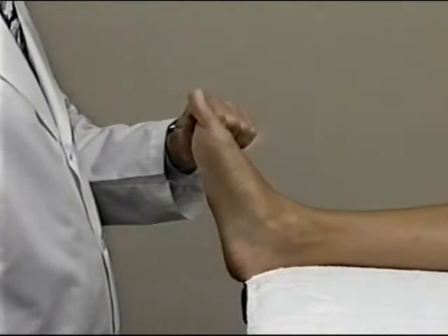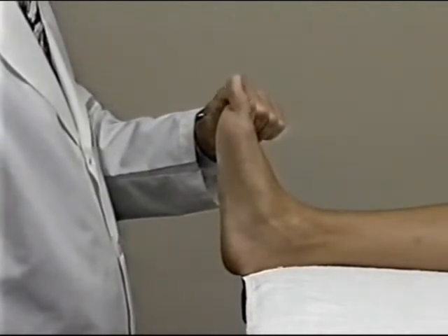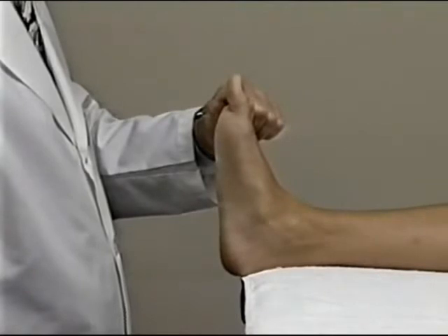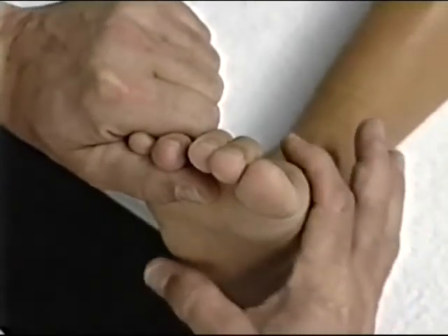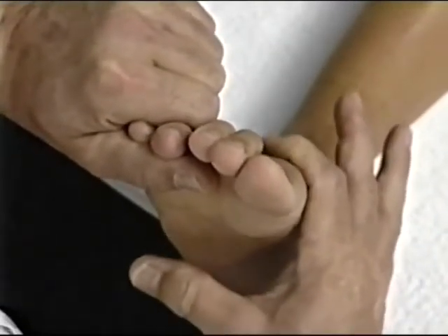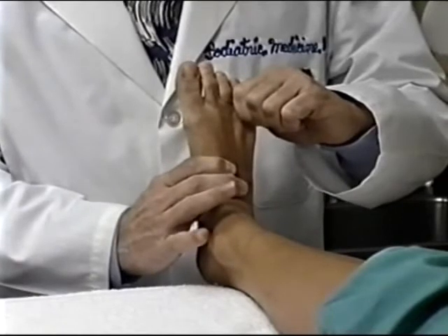The second objective is to make sure the forefoot is dorsiflexed on the rear foot. You accomplish this by pronating the mid-tarsal joint at the oblique axis. Care must be taken not to move the subtalar joint from its neutral position. The last objective is to make sure the medial column of the foot is fully pronated or plantar flexed, accomplished by pronating the mid-tarsal joint at the longitudinal axis, remembering not to move the subtalar joint from its neutral position.